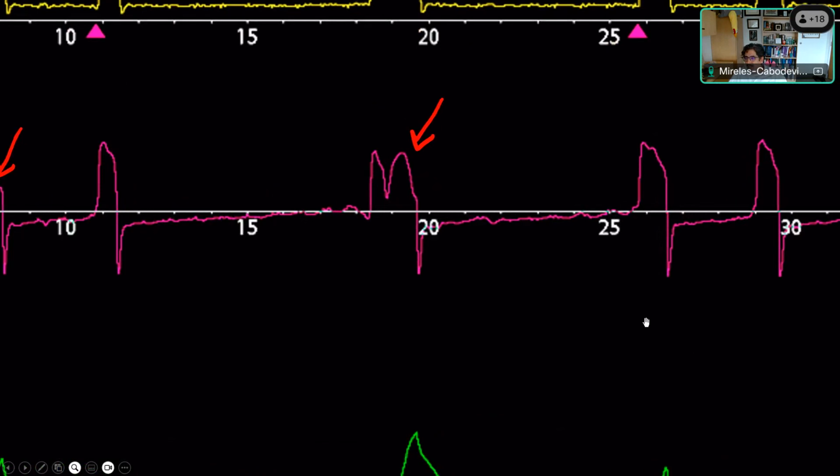Does that help, Leora? Maybe she means what's triggering the spontaneous breath during the early trigger breath. Repeat the question, Rob. On the one right in the middle where you see early trigger, maybe the question was what's causing the patient to inspire after the ventilator triggered the breath? Yeah.